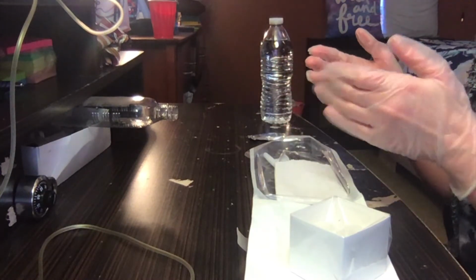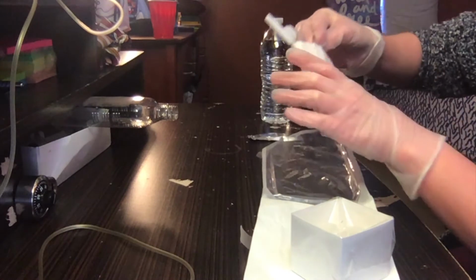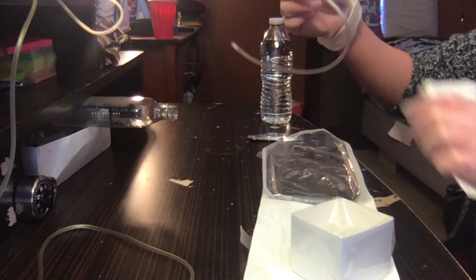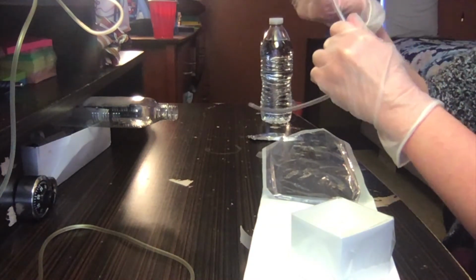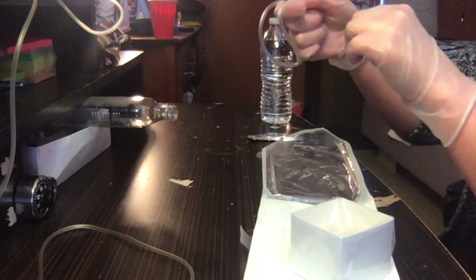Next, with my dominant hand, I'm going to pick up the catheter. And then with my non-dominant hand, I'm going to pick up the suctioning tubing and I'm going to connect it.